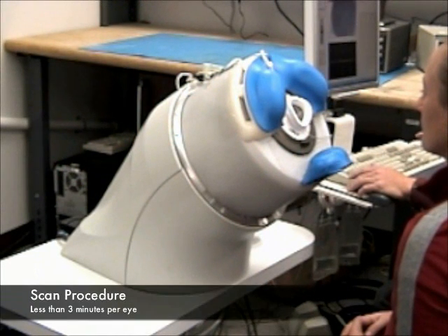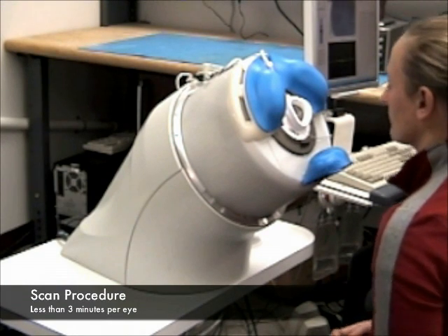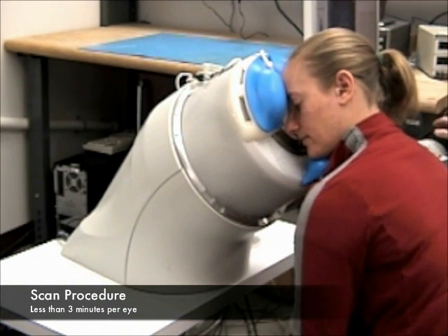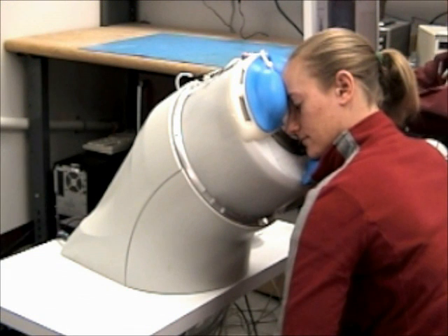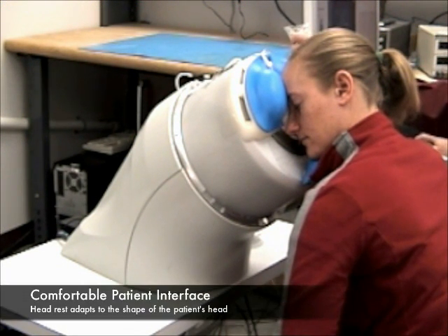Next, we're going to demonstrate the scan procedure. The first thing we do is position the patient on the instrument. When she's got her head comfortably placed on the headrest, we lock the headrest into place to hold it steady throughout the scanning procedure. The next thing we do is fill the eyepiece with sterile saline.